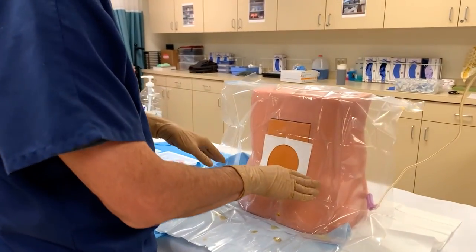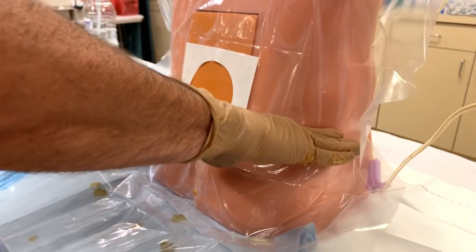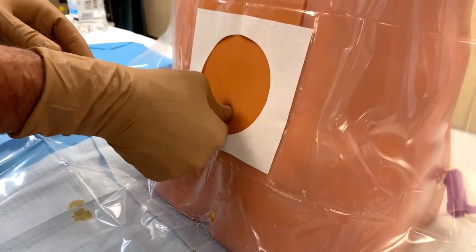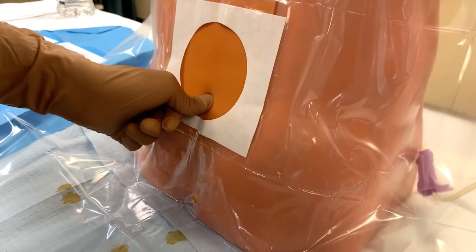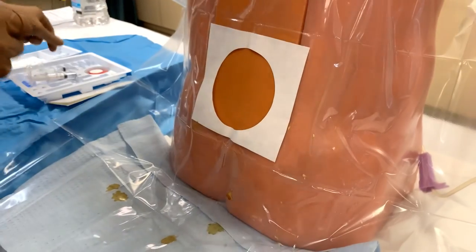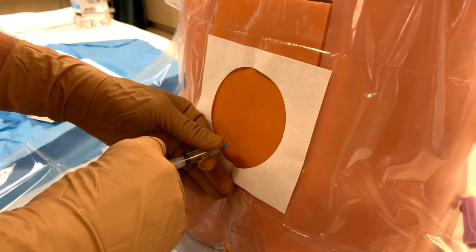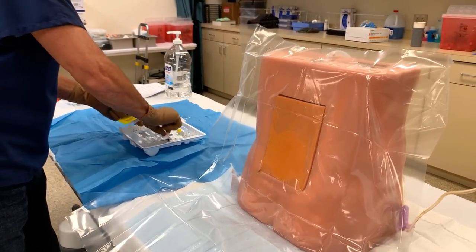With the sterile drape in place, we can palpate the iliac crest and identify our landmarks. With my hands on the iliac crest and my thumbs coming together, this will approximate where the L4-5 interspace is — right where my thumb is — and that is where I will place my skin wheel. We'd use about a cc, raise a nice skin wheel, go in a little deeper, and inject on the way out.